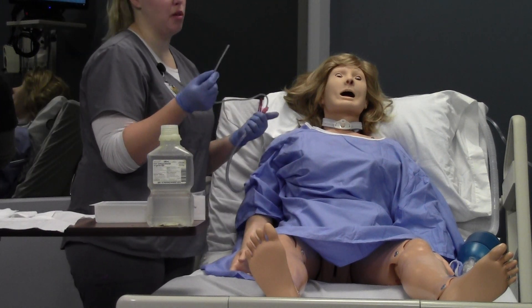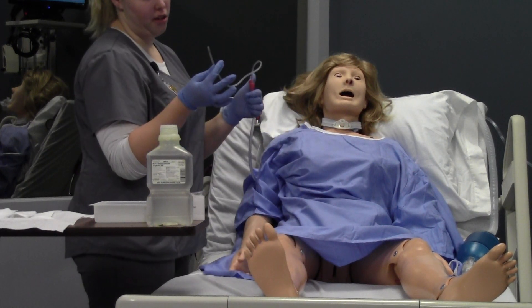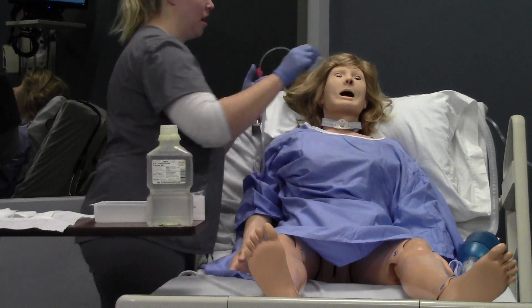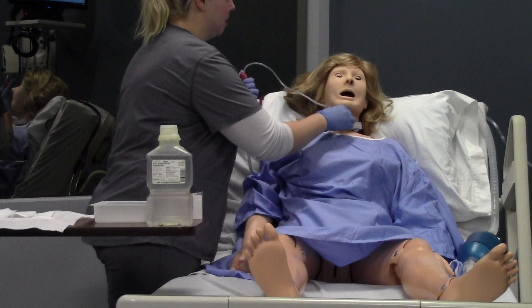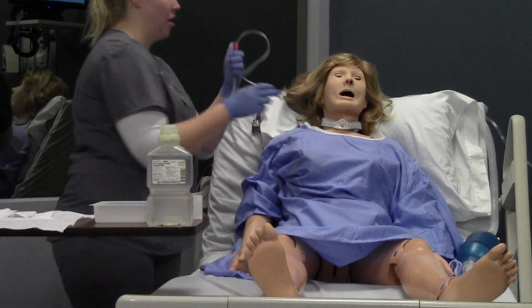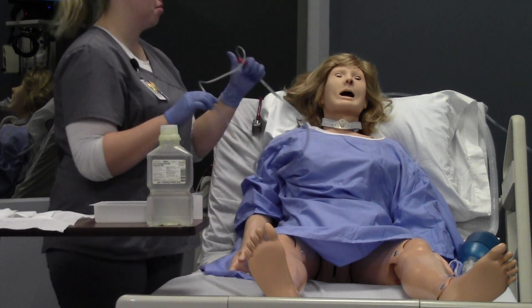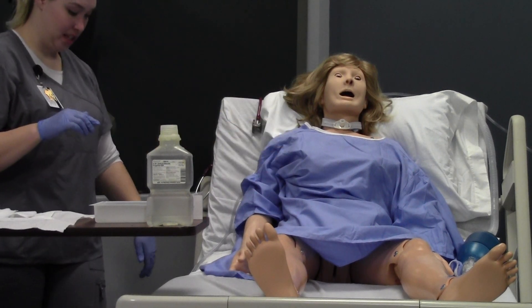When you suction your patient, you can go down a maximum of three times. After they've given two breaths, suction and clean out your catheter. Go down for the second pass — shoot right through the middle, not touching anything extra, then suction out and spin out. Please give two more breaths. Clean your catheter and go down for the third and final pass — right down the middle, 15 to 20 centimeters, and twirl out. Remember: when your thumb is up, suction is off; thumb down, suction is on. You're going to give your patient a thumbs-up going in and take your thumb with you coming back. After the final breaths and three passes, go ahead and drop the catheter — onto your chuck or to the side.